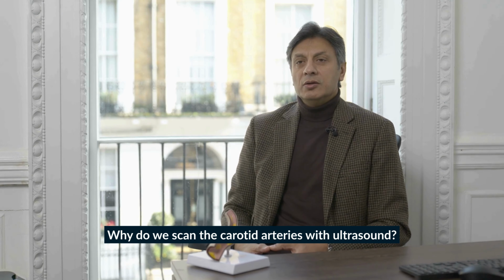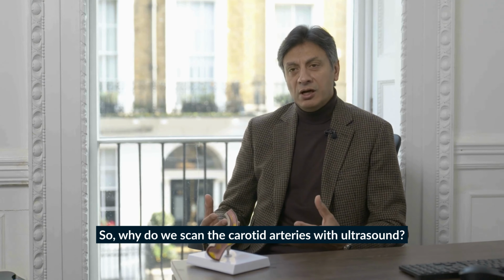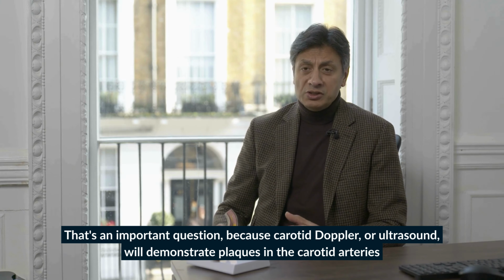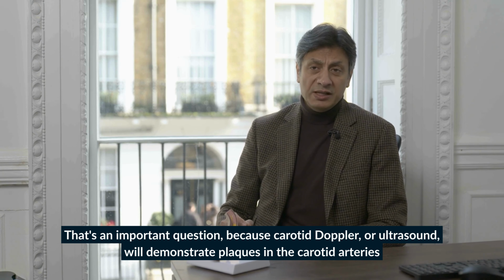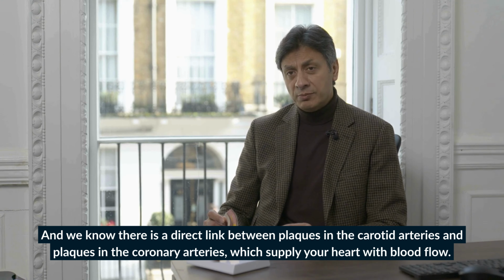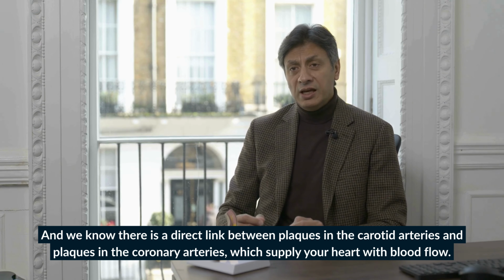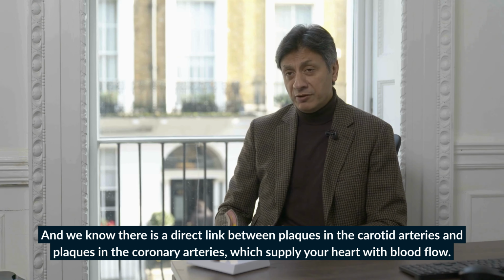Why do we scan the carotid arteries with ultrasound? That is an important question, because carotid Doppler or ultrasound will demonstrate plaques in the carotid arteries, and we know there is a direct link between plaques in the carotid arteries and the plaques in the coronary arteries which supply your heart with blood flow.